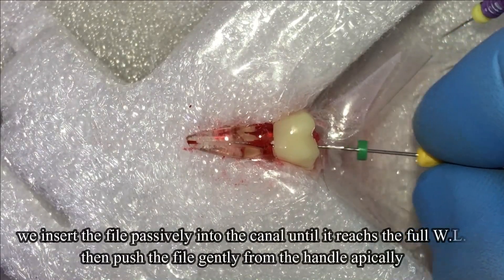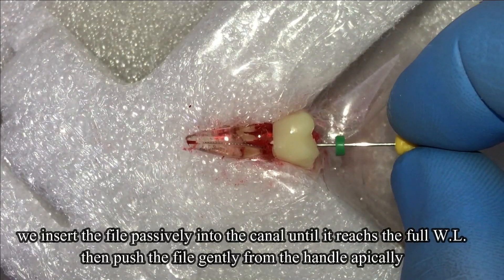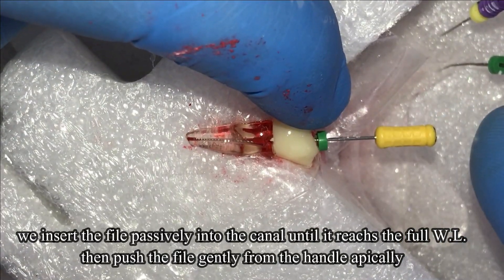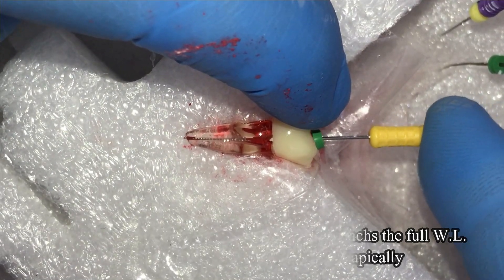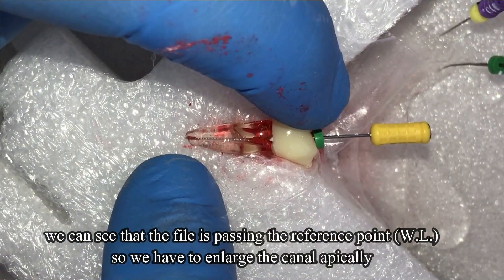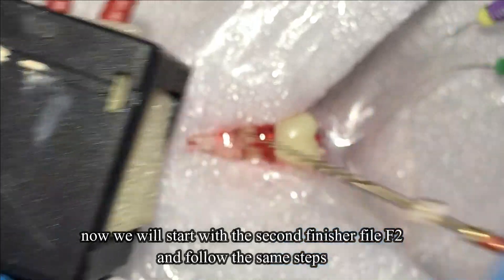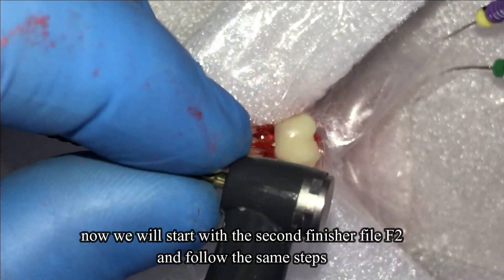We insert the file passively into the canal until it reaches the full working length. Then we push the file gently from the handle toward the apical direction. We can see that the file is passing the reference point, so we have to enlarge the canal apically. Now we will start with the second finisher file, which is F2, and follow the same steps. We measure the file to our working length, which is 21 mm.